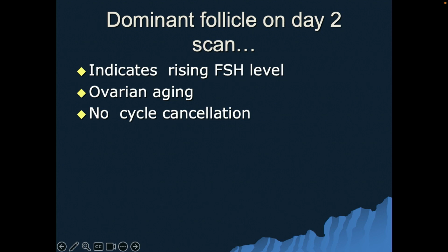about. If you see that it appears like a corpus luteum or a hemorrhagic cyst, that is when you put on the Doppler. If you see a fishnet pattern, honeycomb pattern, fibrin strands inside, put on a Doppler, and if you still see a nice ring of color with a low resistance flow, that tells you that this is a residual active corpus luteum of the previous cycle. Confirm that the endometrium is thickened and hyperechoic. Confirm with the patient that she is not ovulating this cycle. That tells you this is a residual active corpus luteum.